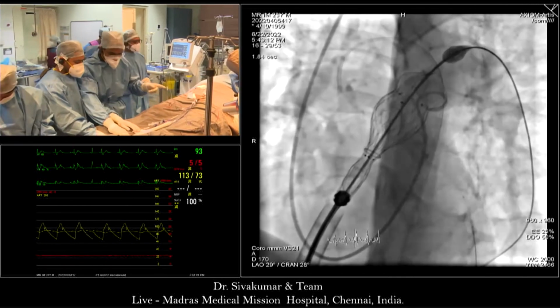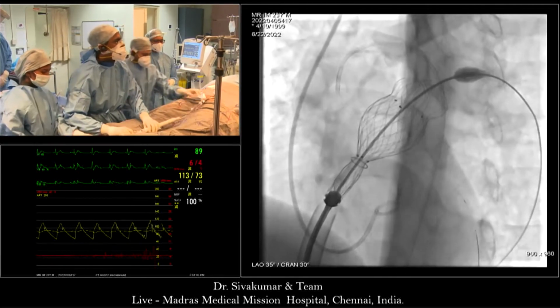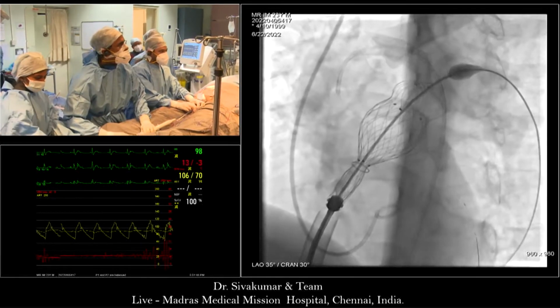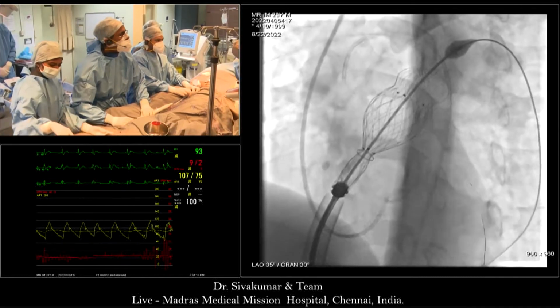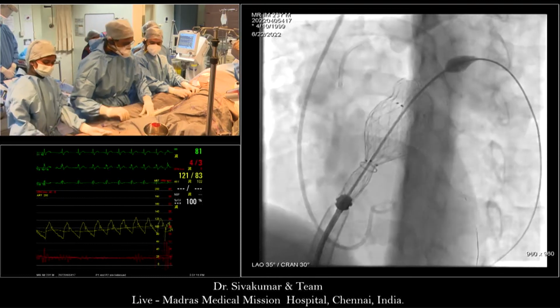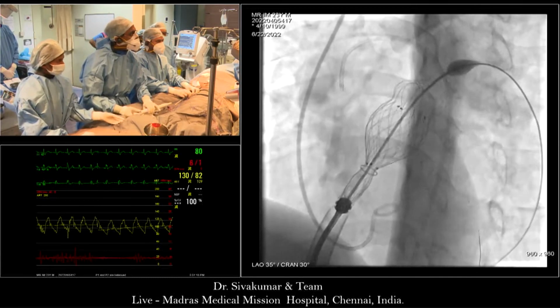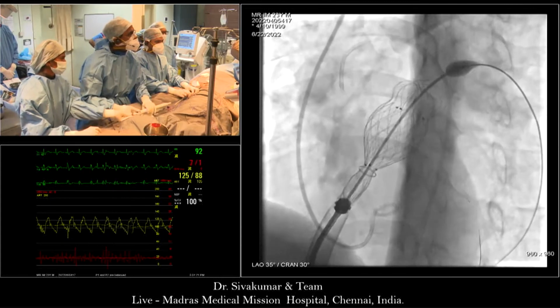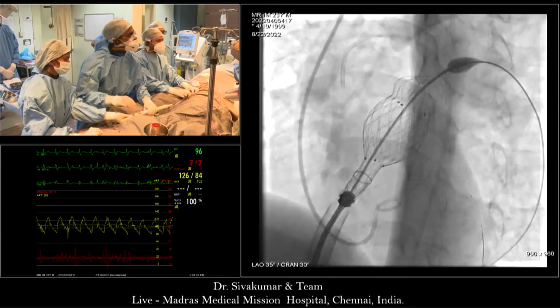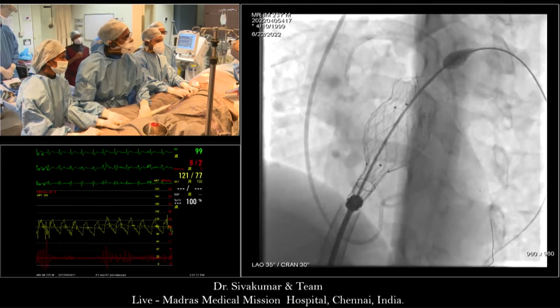Okay. So, obviously this is no good, but in retrospect, if anything, the 25 length would have been better. Yeah, I just wanted to mention that too. I think the actual main pulmonary artery is quite short. If you look at the outflow tract altogether, it's elongated, but the portion of the main pulmonary artery itself is quite short.